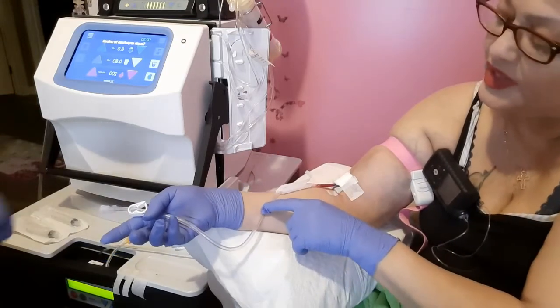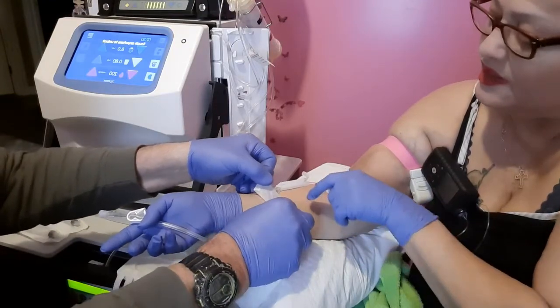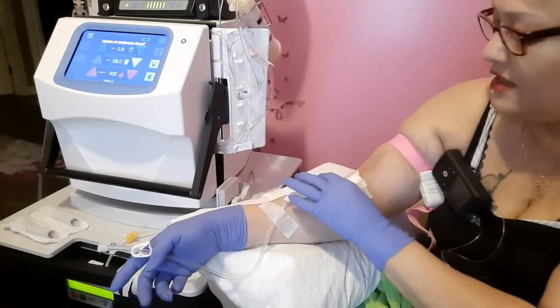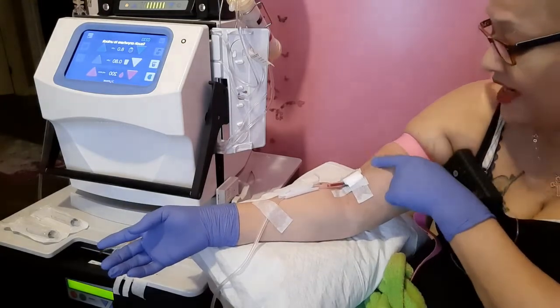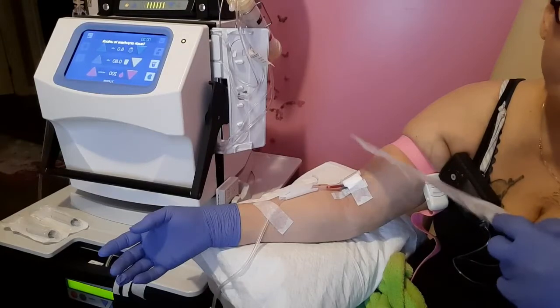Okay, Hafsa, will you take that for me right there, please? Alright, so he's taped my arteries, and I can let this go. It won't go anywhere. Now it's time for the venous. This is the problem child.